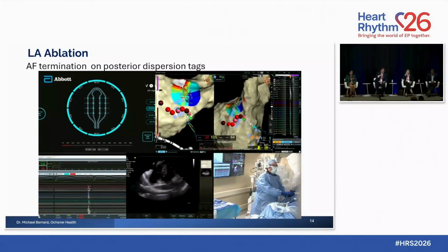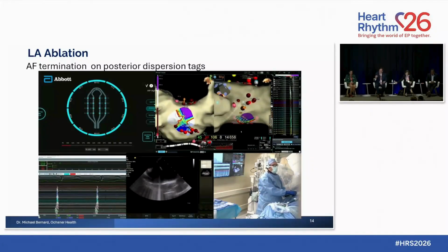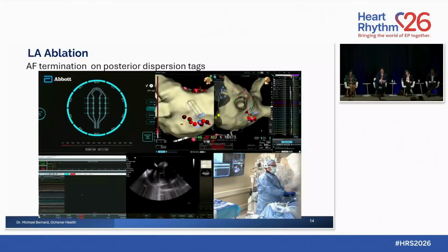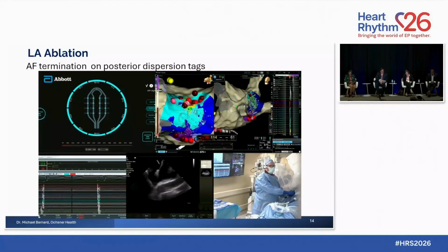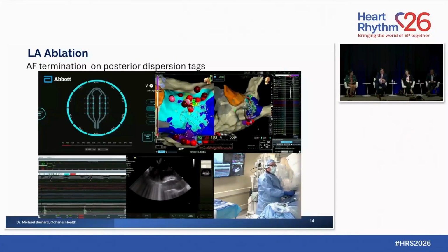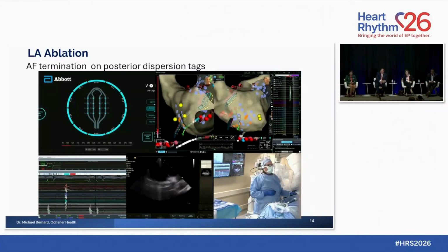The posterior wall is not isolated this time. So it wasn't where we got posterior wall isolation. It's when we went through that cluster. And so then we went ahead and finished off the posterior wall, did the low left atrial tags, and we did ablate those 2 areas in the right atrium. We did do an induction run post and did not stir up any tachycardia.